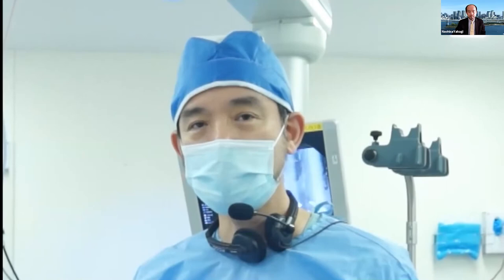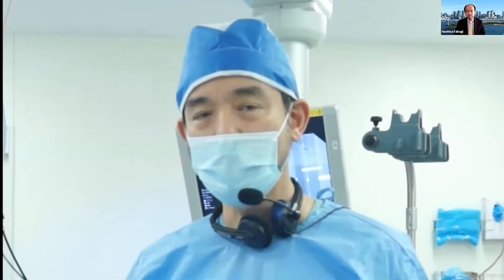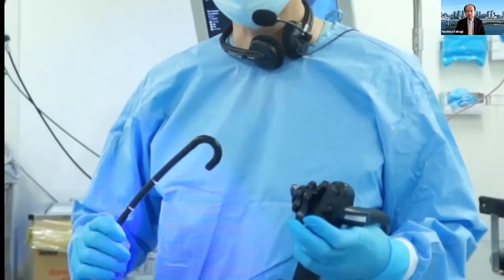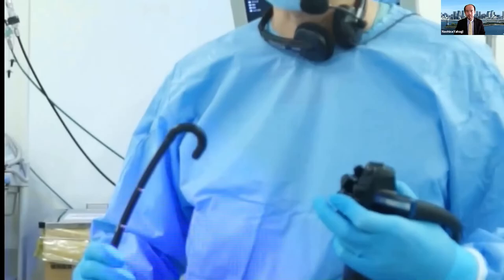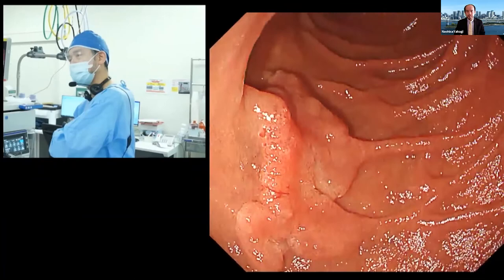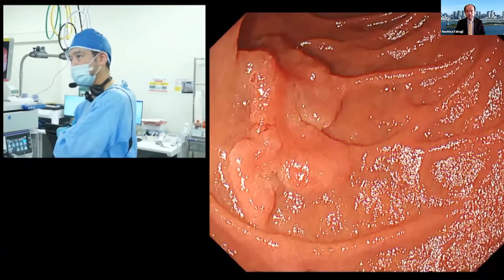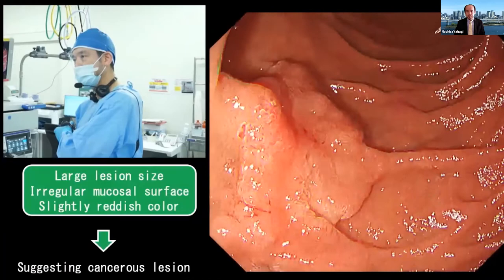I'm going to perform duodenum ESD today using Olympus's therapeutic endoscope, the GIF H290T. This endoscope has a shorter bending part, which is very important for complicated duodenum ESD because of easier maneuverability and better approach to the target region. This is the major papilla, and our target region today is located at the posterior side of the upper second part of the duodenum. The lesion size will be around four centimeters in the longitudinal direction.